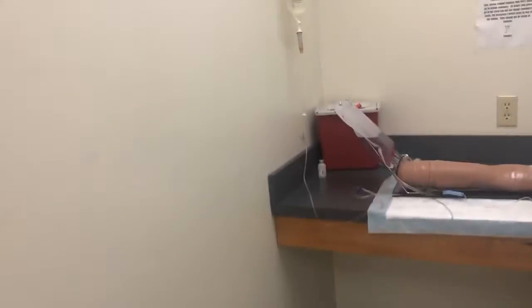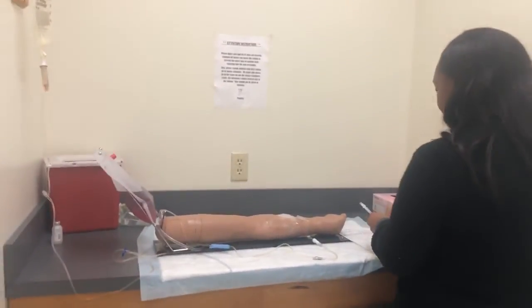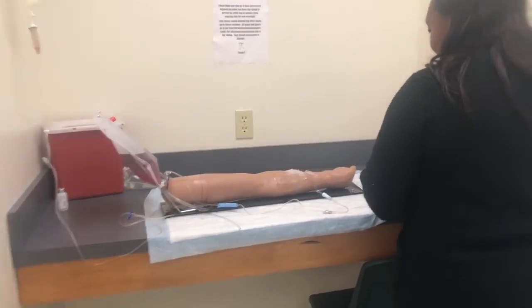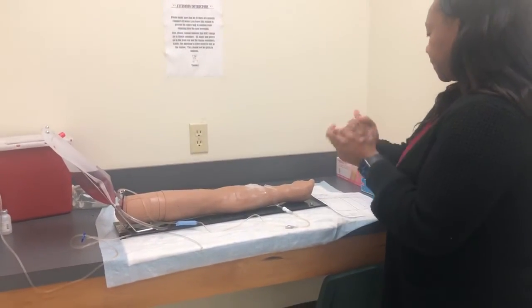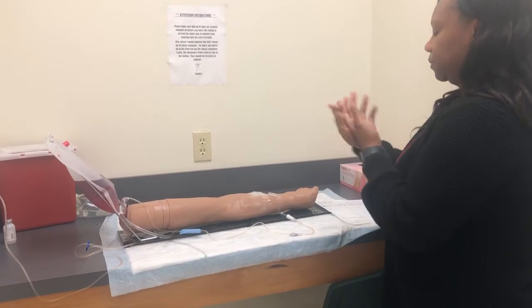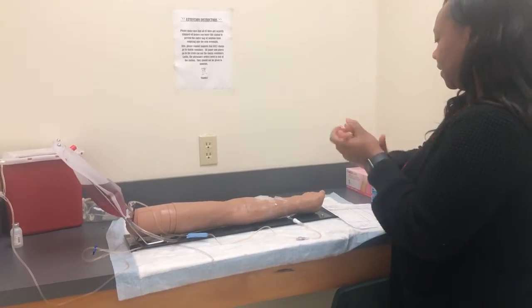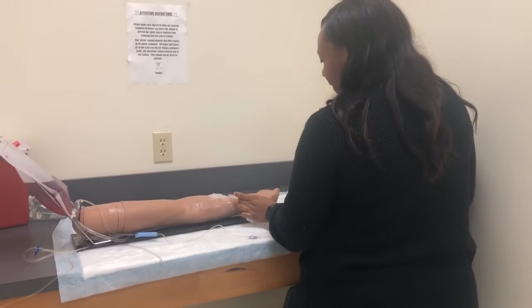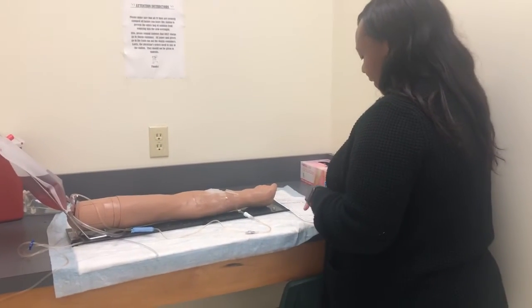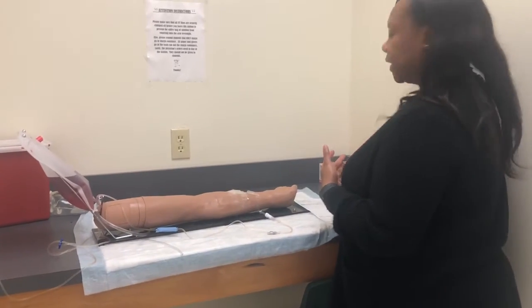Hi, Miss Green. How you doing? My name is Victoria Harris. I'm a student nurse from Harris Community College, and today I have an IV push that I need to do for you per doctor's order. But first, I'm going to get you identified. Can you say your name and date of birth for me? She said her name is Janet Green, date of birth 6/3/1972. Are you allergic to anything? She said she's allergic to penicillin.